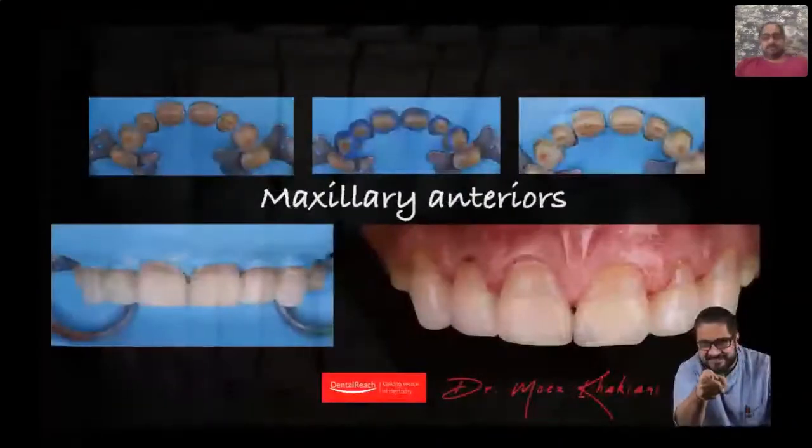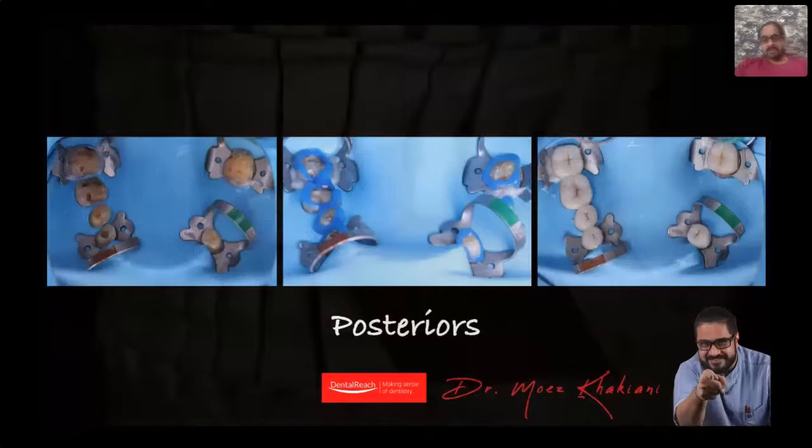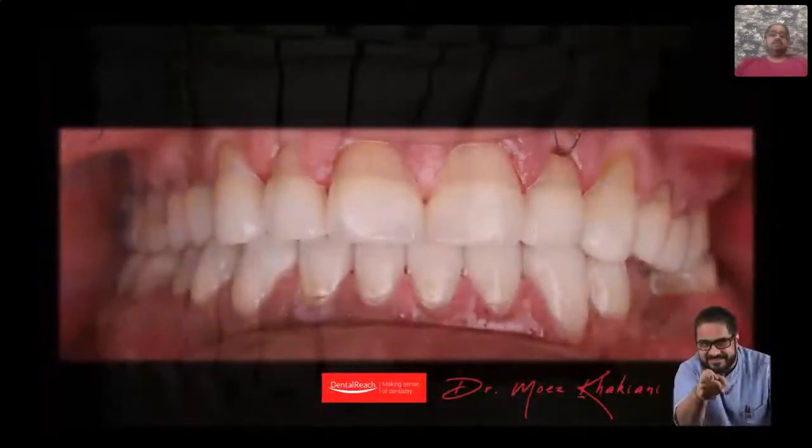I go into the patient's mouth, I rubber dam, isolate everything. I do a selective etch technique. I go ahead and bond my maxillary anteriors, my maxillary posteriors, my mandibular anteriors, my mandibular posteriors. And this is how it looks post bonding. MIP equals CR in static occlusion.